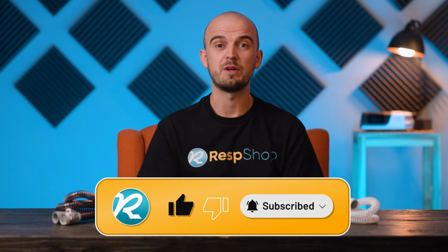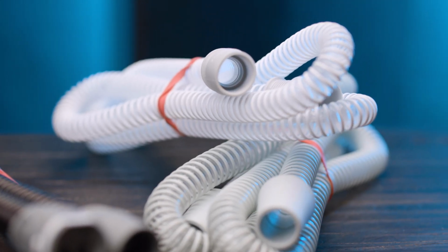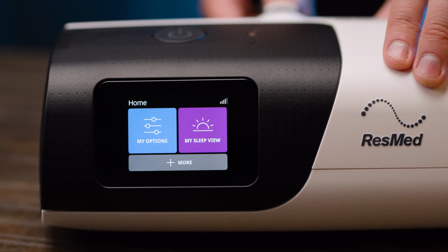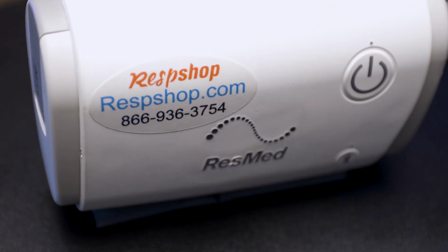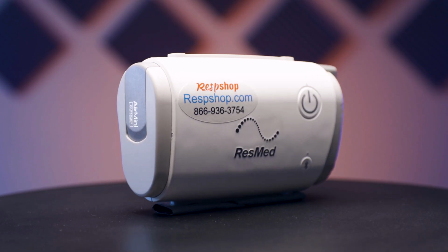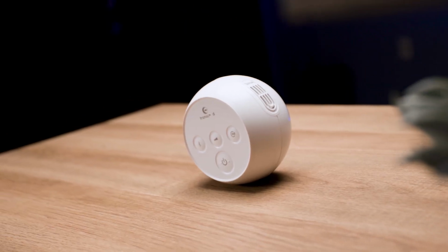The first thing to decide when choosing a tube is whether to get a heated tube or a non-heated tube. Sometimes a heated tube isn't an option for you, as it will depend on what CPAP machine you're using. Many popular at-home CPAPs like the ResMed AirSense 10 and 11 and the Luna G3 are compatible with heated tubing. But many of the popular travel CPAPs such as the ResMed Air Mini, Breeze Z2 and the Transcend Micro are incompatible with heated tubing. So check your device, and if it isn't compatible with heated tubing, you can skip this decision and move on to the next.